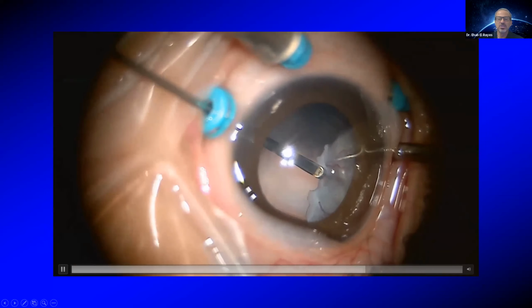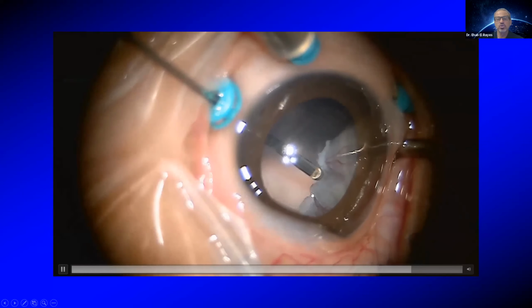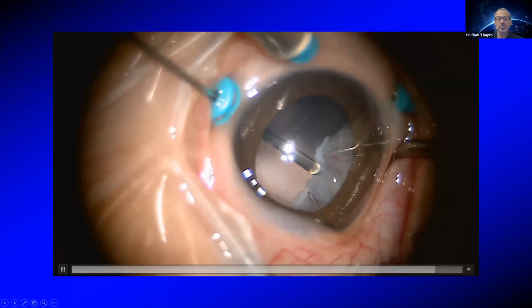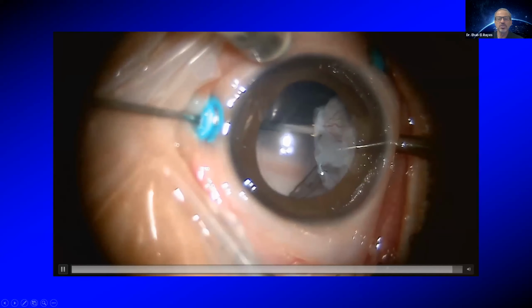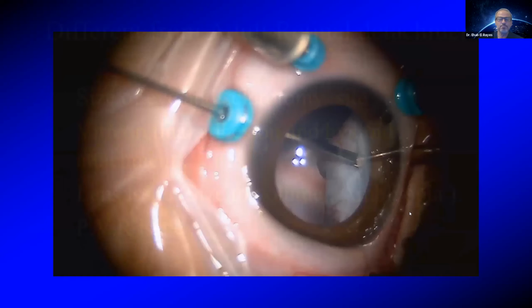What I'm doing is separating two retinal folds and using the cutter with controlling the duty cycle to use it as a vertical scissor to cut into this fibrous tissue to separate these two retinal folds instead of exchanging lots of instruments inside the eye.